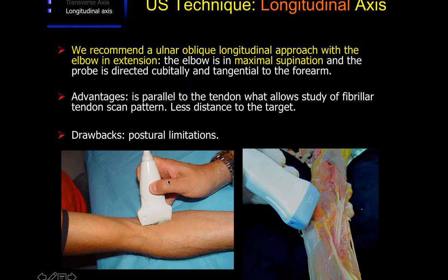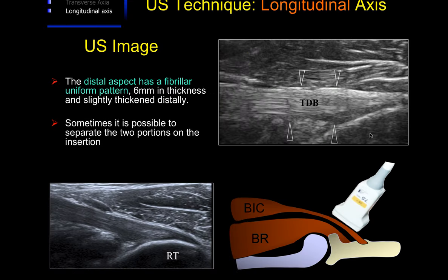For longitudinal ultrasound examination, we recommend an ulnar oblique approach with the elbow in extension and maximal supination, directing the transducer tangential to the forearm. This technique enables the evaluation of the fibrillar pattern of the tendon. Careful orientation of the probe is really essential to avoid misinterpretation from anisotropy artifacts. The distal aspect of the tendon has a really fibrillar uniform pattern, about 6 mm in thickness and slightly thickened distally.